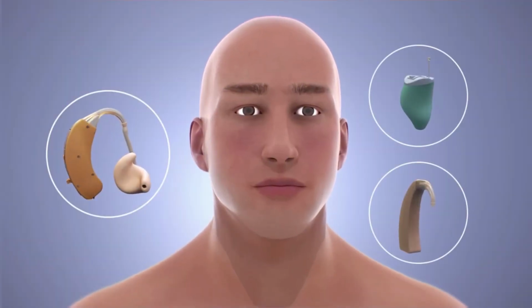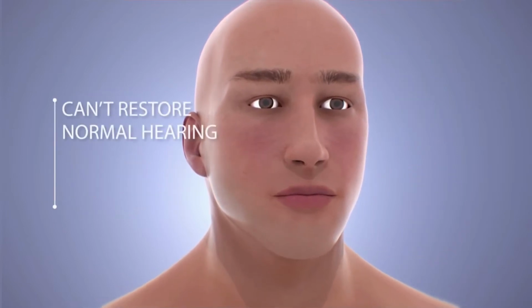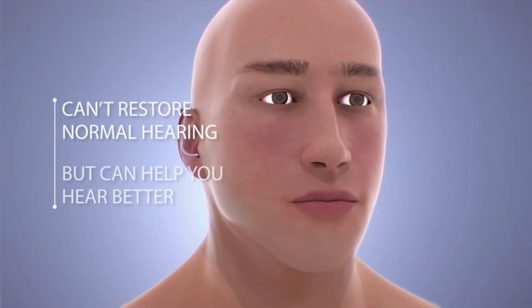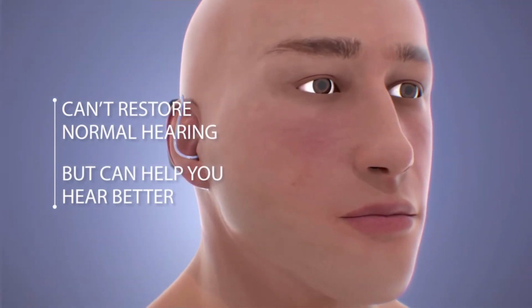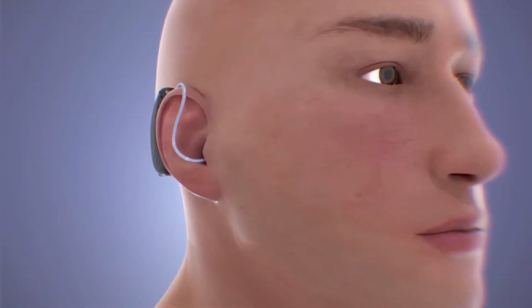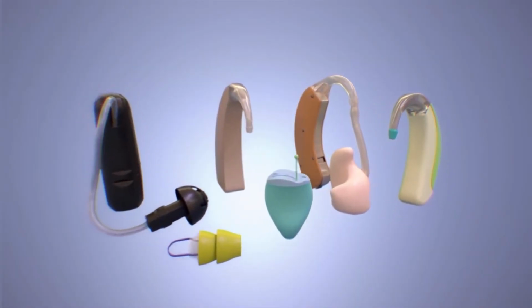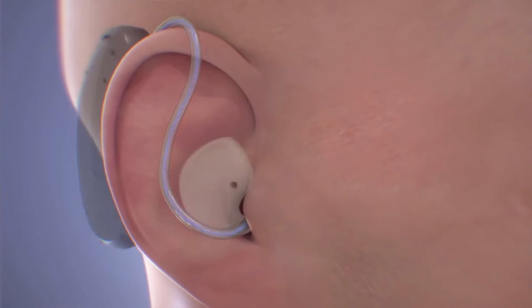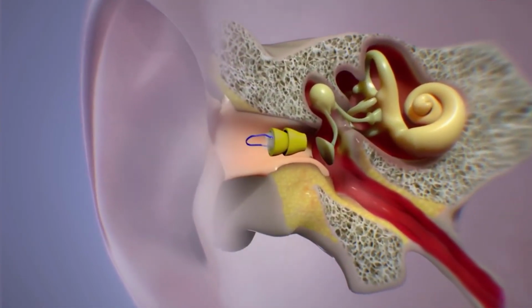Hearing aids are small electronic devices that amplify sound. While they can't restore normal hearing, hearing aids can help you hear better by making certain sounds louder in both quiet and noisy situations. Hearing aids come in several styles that fit in or on your ear in different ways, including behind the ear, in the ear, in the canal, and completely in the canal.